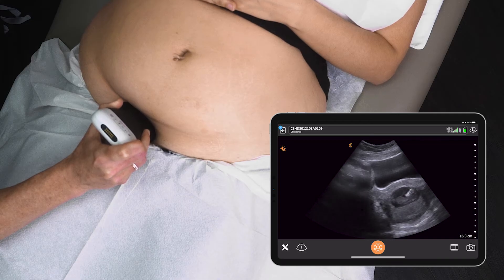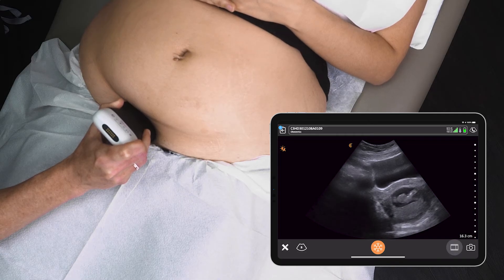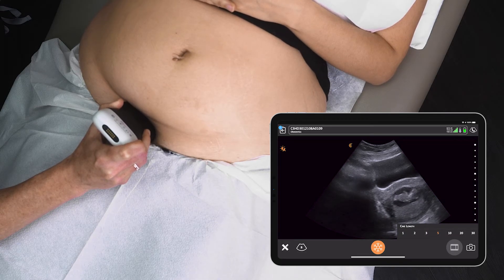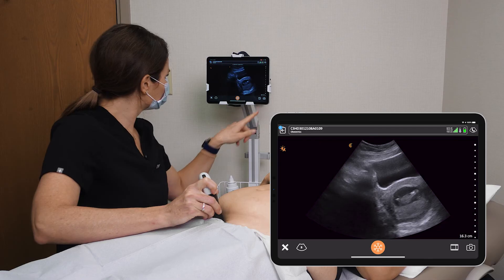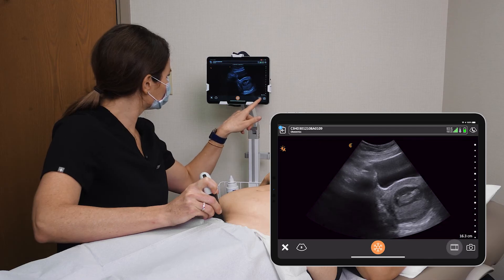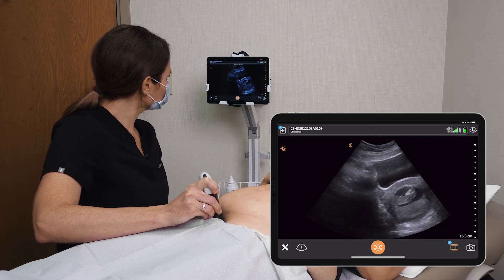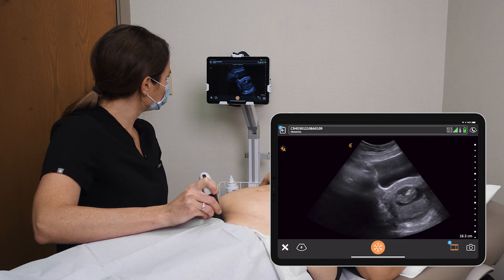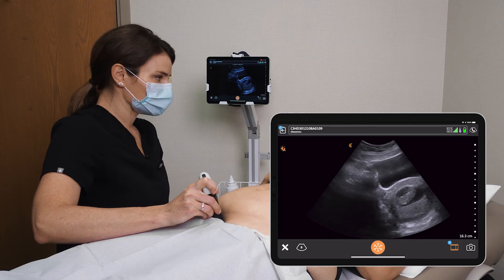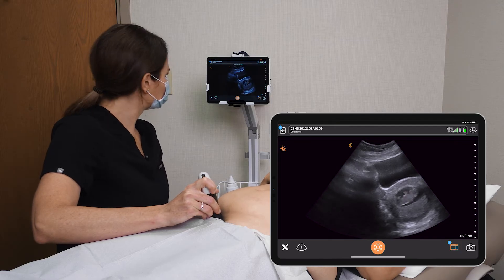It's a nice active baby! Let's take a little bit of a longer video here. The baby's very active — knows it's on camera.